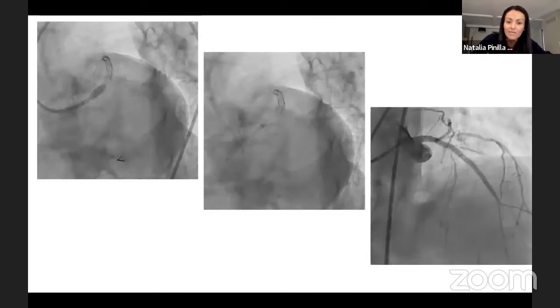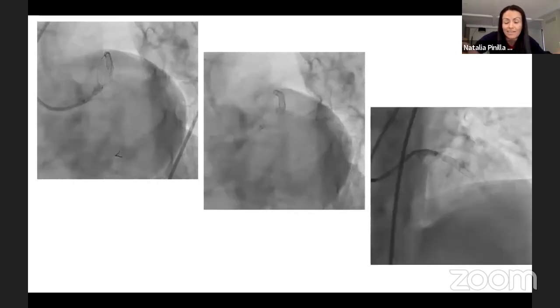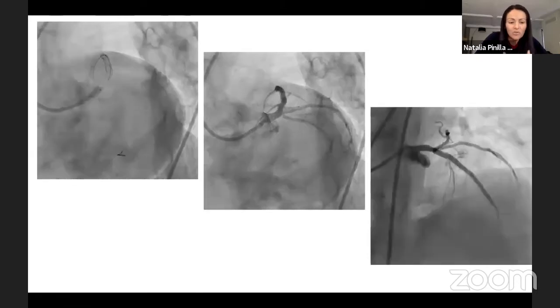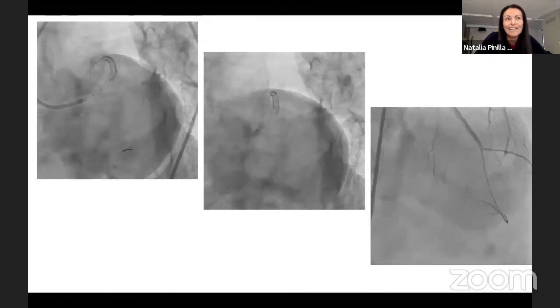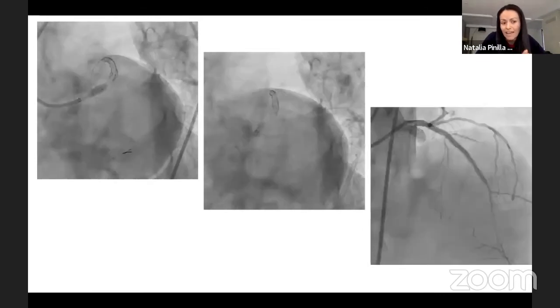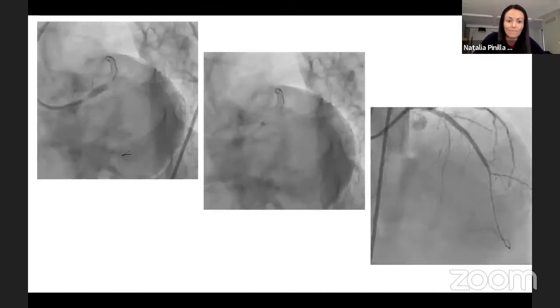And that's the beauty of imaging, because if you were able to clear up the ostium of the side branch with your POT, that's the work of the POT, right? It opens the struts into the carina to the side branch. If that's properly seen in the post PCI, honestly, I don't do kissing balloon in all my provisional bifurcation PCI. And doing it consistently, you have a chance of dissecting a branch that has no disease. In this case, they show beautifully how the ostium of the ramus was never affected pre or post PCI, but it's because they sized very well the stent, not only the stent, but the POT balloon.